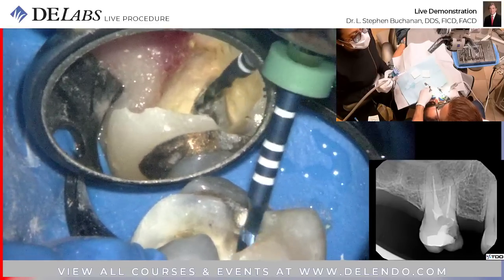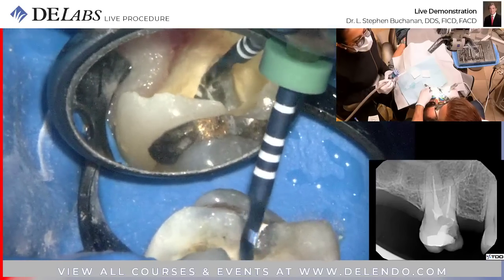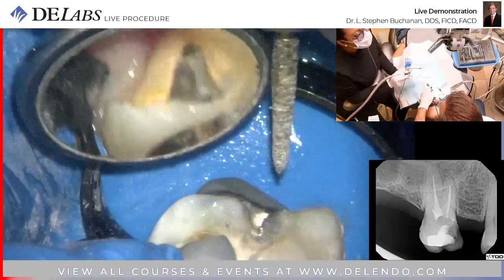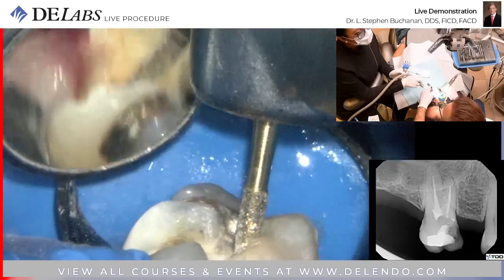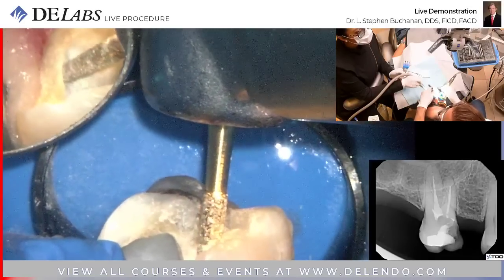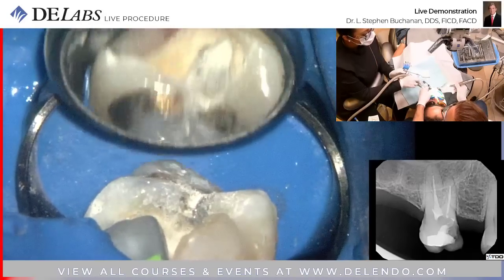Do we have an estimated length? Yes, MB is 19 1/4. Okay, so our estimated length is 19 1/4. I'm a millimeter, 2 millimeters short. I need to make it just a little easier to find that MB2. There we go. Cool.